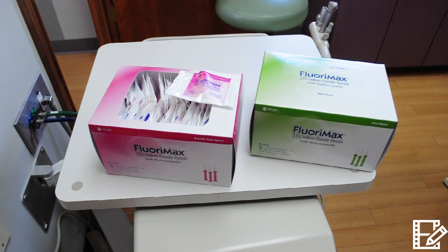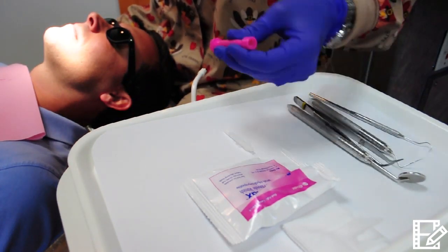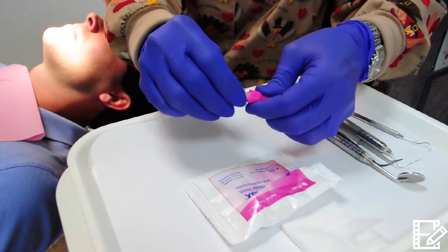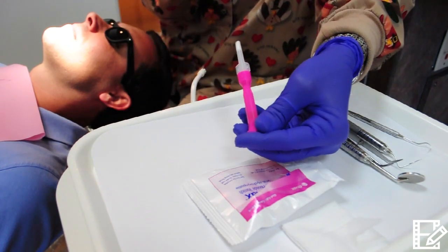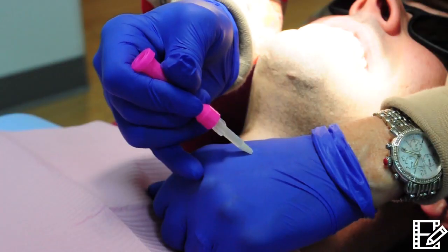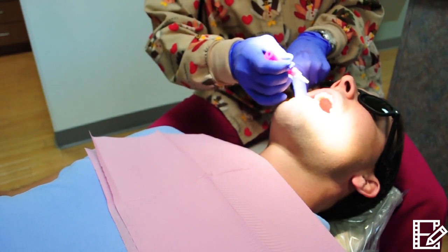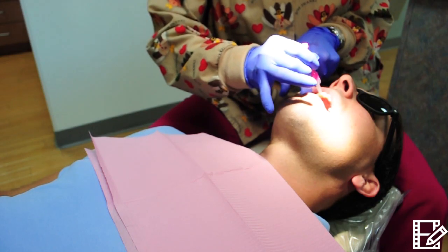Let's complete the application on the opposing side with the new Floromax flow-through applicator. The new flow-through delivery system enables great, fast application compared to peel-and-mix sticky varnishes. Select your flavor and shake the applicator to mix the varnish. Screw in the provided flow-through brush until you feel it click into place. The varnish is now ready to flow. Evacuate pooled saliva but don't dry the teeth. Squeeze the ampule to moisten the brush — do this over the gauze or the back of your glove until you get used to how much pressure is needed to wet the brush without dripping.